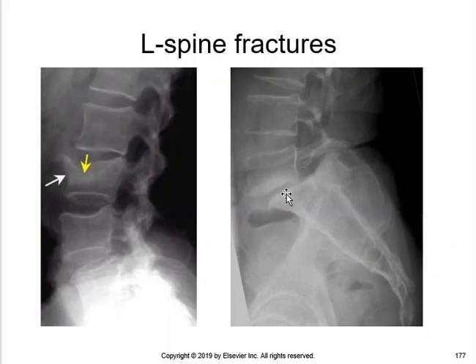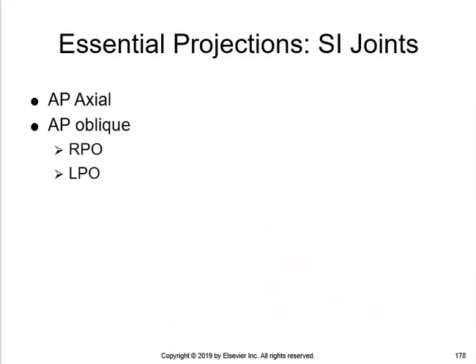I think I mentioned this in the anatomy portion. This is what you would call spondylolisthesis. Technically what you've got is a subluxation appearance, but it's non-traumatic, and it's not that much of an issue for the patient. It's usually asymptomatic and an incidental finding.